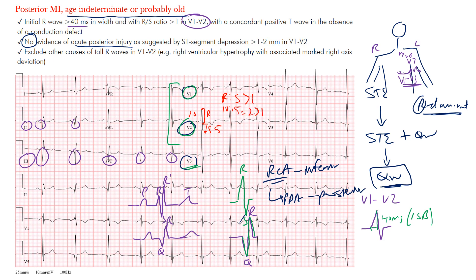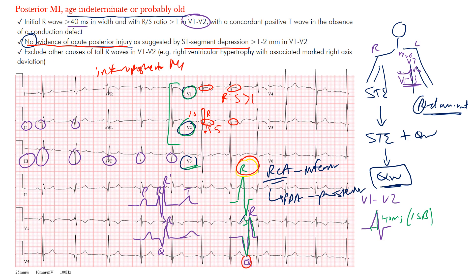For example, if the R wave is about 10 millimeters and the S wave is about 5, then R-to-S equals 2, which is greater than 1. So the R-to-S ratio is greater than one, the initial R wave width is 40 milliseconds or more, and you may see concordant T waves — though that's not always the case. The main thing is seeing the opposite changes representing posterior Q waves, and in the inferior leads confirming inferoposterior MI.